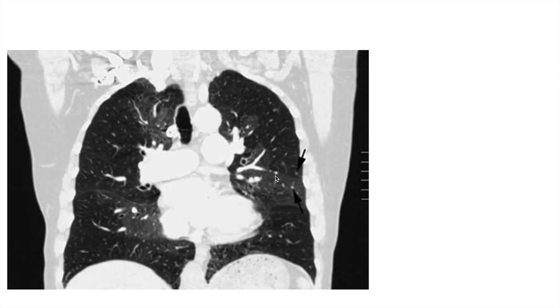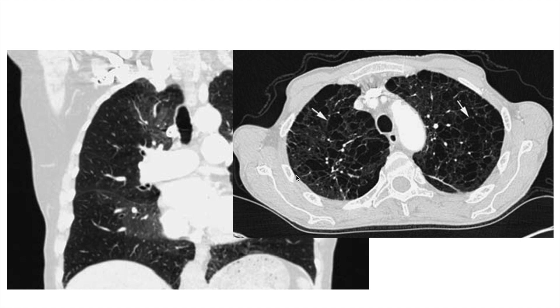Here we can see areas that are normally perfused while some areas are less perfused, resulting in hypoattenuated lungs. This is seen especially in patients who have had recurrent episodes of pulmonary embolism, with a difference in calibre of vessels in areas not properly perfused. We can also see emphysematous changes causing decreased attenuation through destruction of lung tissue and increase in air.